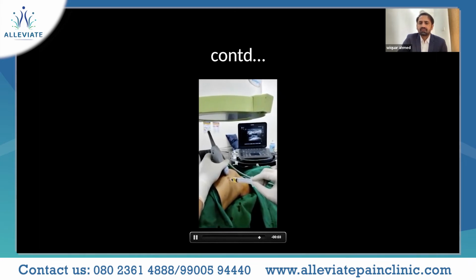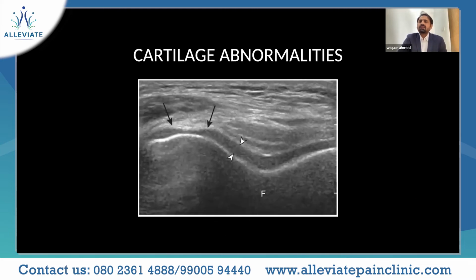In this case, it looks like an inflammatory fluid, and it can be hemorrhagic. It can be whitish in color. In rheumatoid, you can usually see that. And to rule out even infections, it's important that you always send it, with the consent of the patient and relatives.